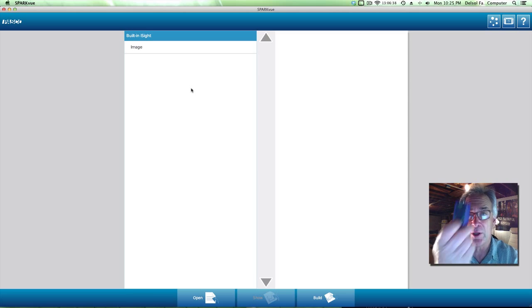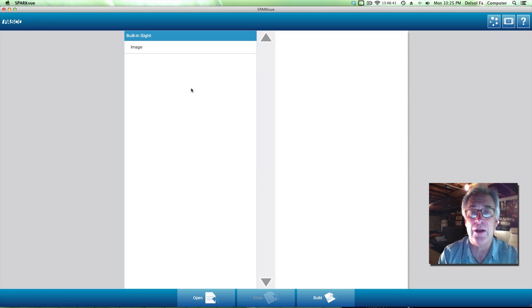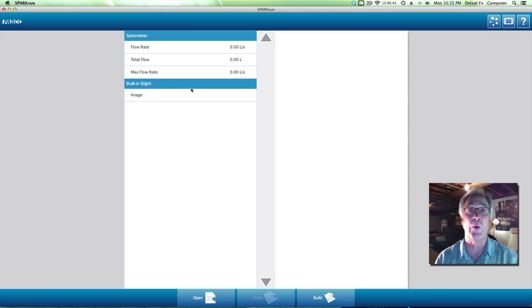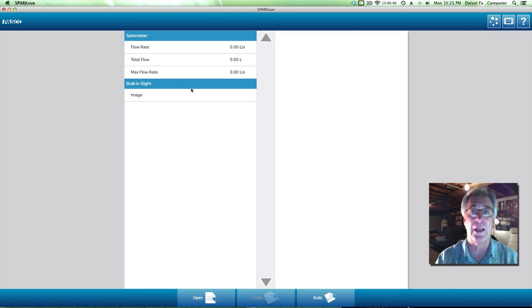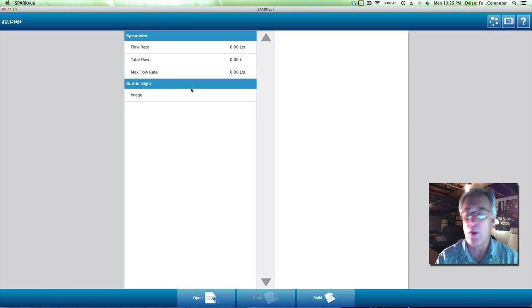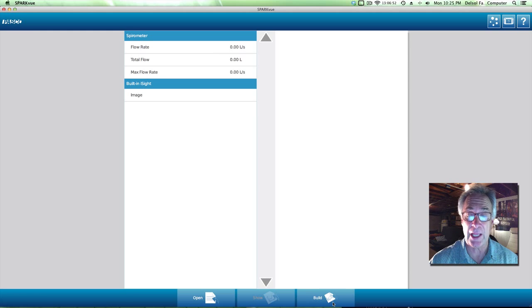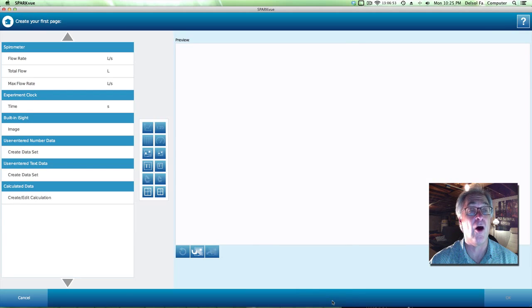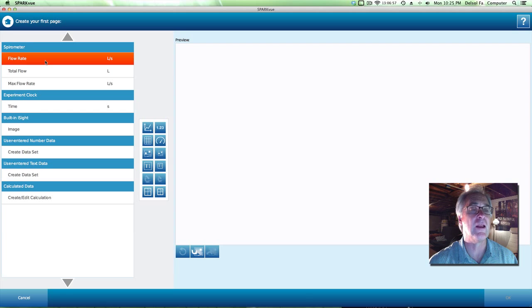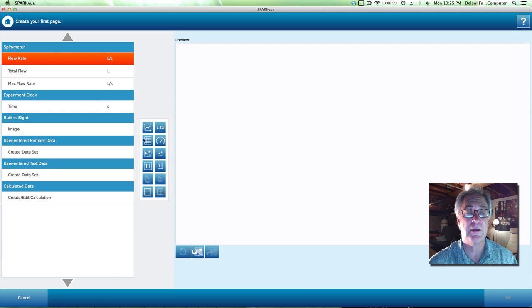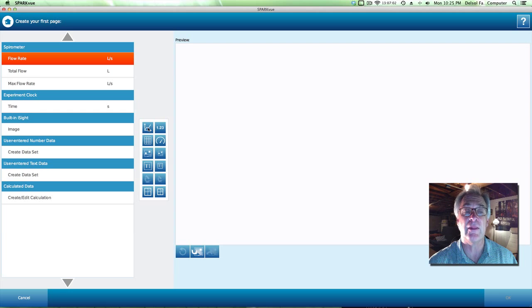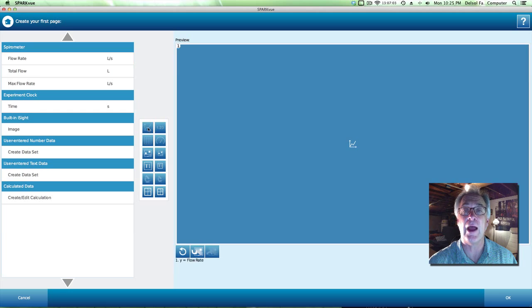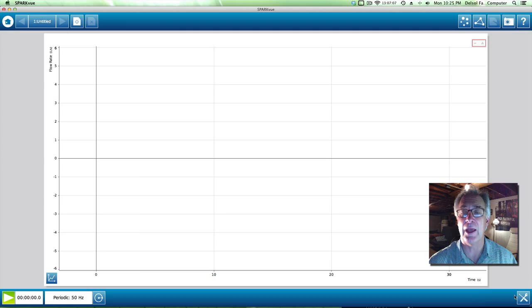So I'm going to take this amplifier box and put it in our data port and notice what happens. As soon as we put that in, the data logger recognizes it. And we're going to build the page just like we've done on all the other demonstrations I've done. So you're going to click flow rate or liters per second. And all you're going to click this time is you're just going to go ahead and click the graphing tool. So when that launches, you're going to press OK.